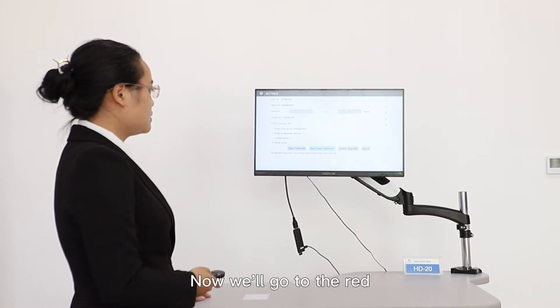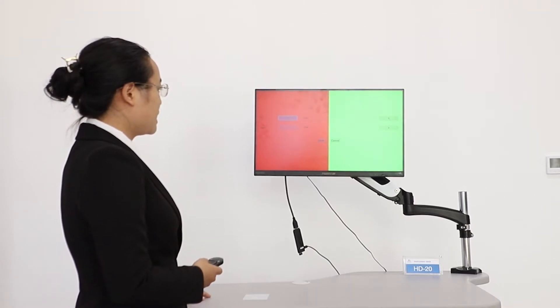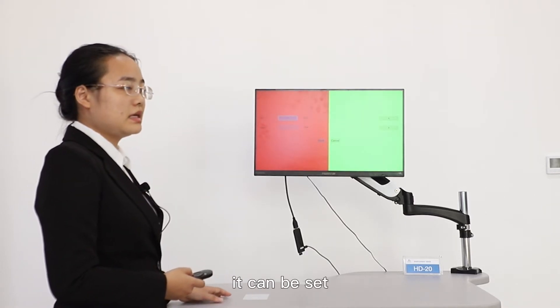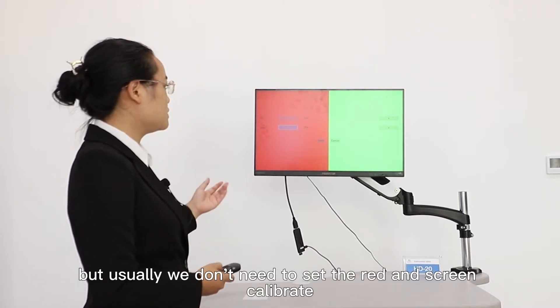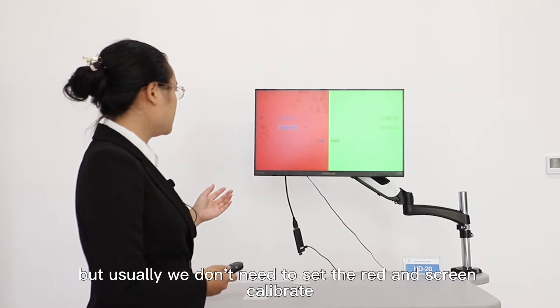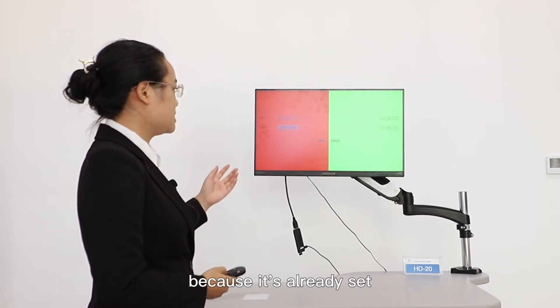Now we will go to the red-green calibrate. As you can see, it can be set. But usually, we don't need to set the red and green calibrate because it's already set.